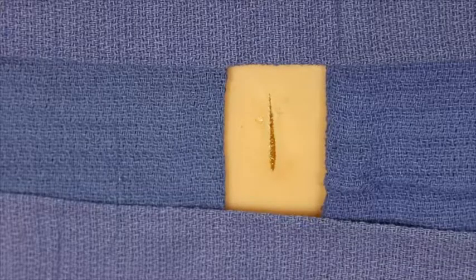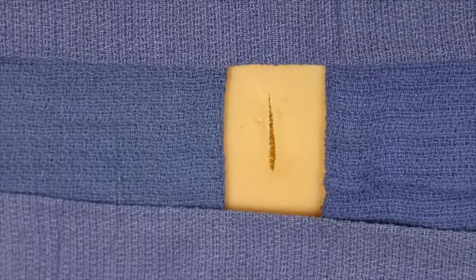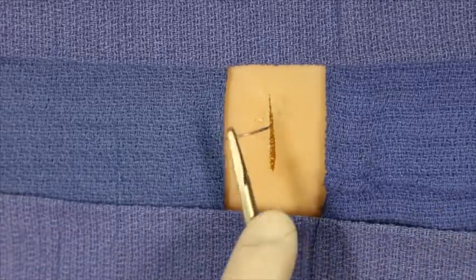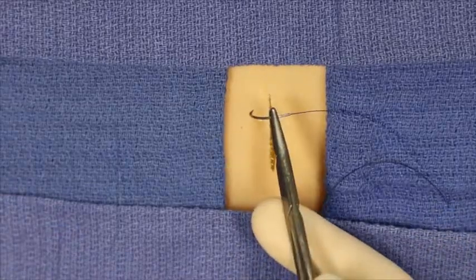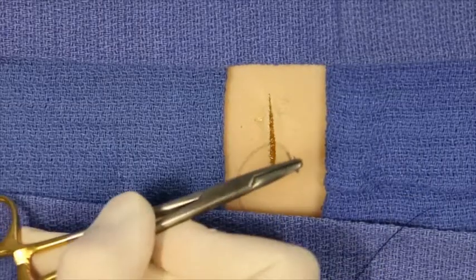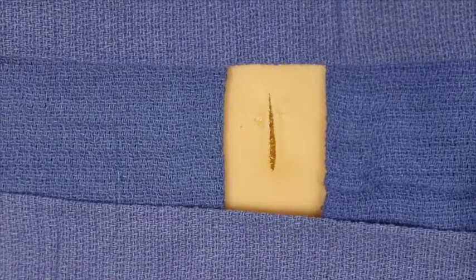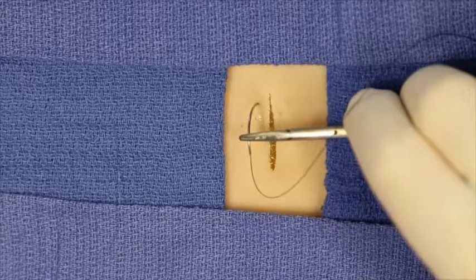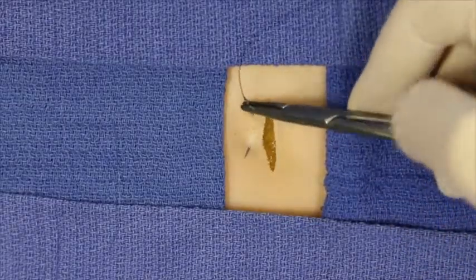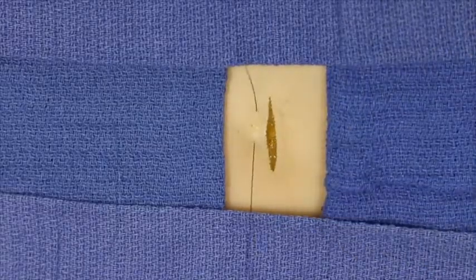The inverting horizontal mattress technique is an occasionally used technique. Rather than beginning as a horizontal mattress suture and going across the wound edge, the first pass of the needle moves parallel to the wound edge. Here, for example, the needle is inserted at 90 degrees, again parallel to the wound edge, exiting further along the edge.